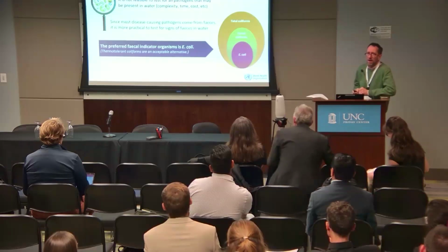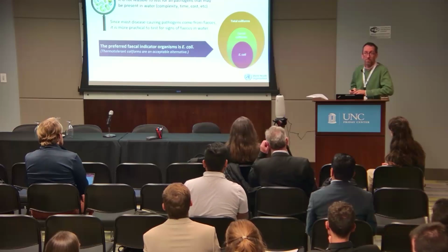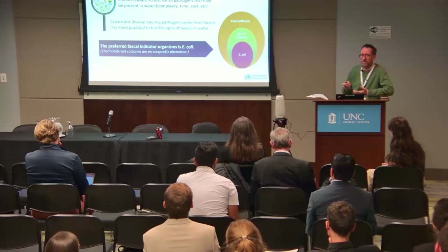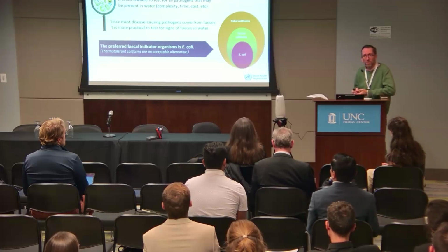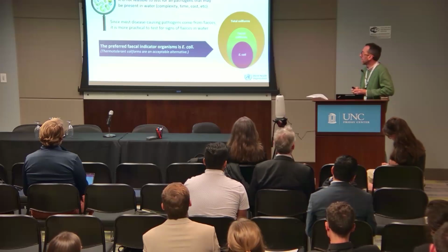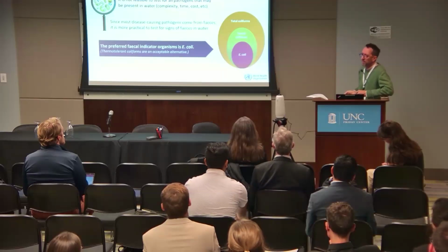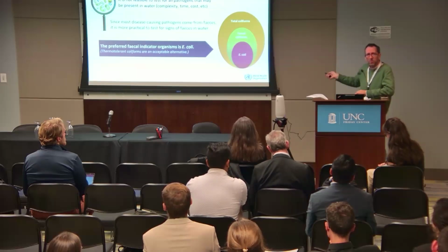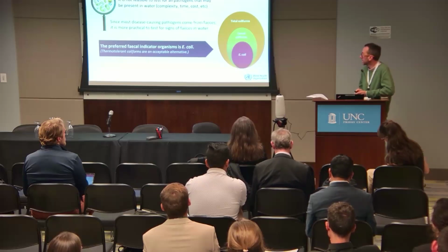I think in this audience, we don't need to justify why it's important to test microbial quality or the concept of indicator bacteria. Obviously, there are so many different pathogens, we can't test for them all. So we look for indicator bacteria or other indicators of fecal contamination, and the recommended fecal indicator bacteria by WHO is E. coli, which is a subset of fecal coliforms or thermal-tolerant coliforms, which is in turn a subset of total coliforms. So you might see any of those indicators being used for water quality testing.